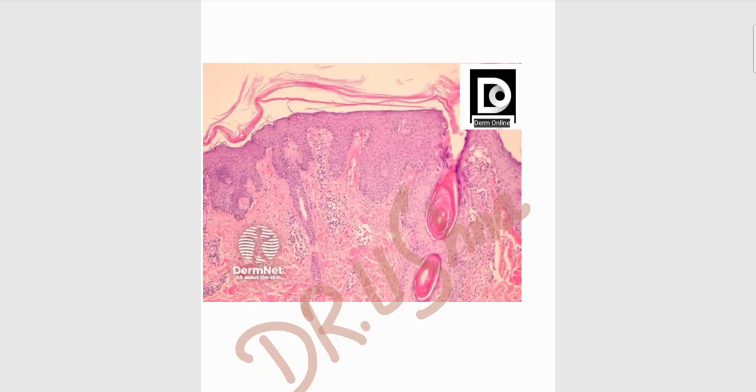Today we are about to discuss the histopathology of Pityriasis Rubra Pilaris. It's a great disorder which has a key microscopic feature which has helped to understand the characteristic pattern of the histology of the PRP. By the end of the session, you will be able to confidently recognize the histological hallmarks of PRP and apply them in the clinical practice and examination setting.